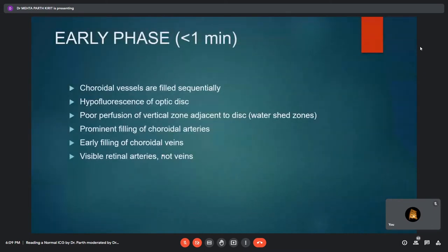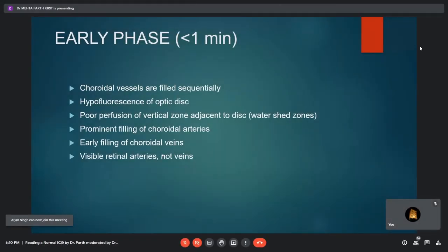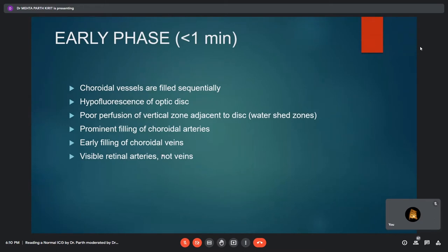Coming to the phases of ICGA, in the normal early phase — occurring within less than 1 minute — the choroidal vessels are filled sequentially. There is hypofluorescence of the optic disc and poor perfusion of vertical zones adjacent to the disc known as watershed zones. There is prominent filling of choroidal arteries, early filling of choroidal veins, and gradual filling of retinal vasculature.